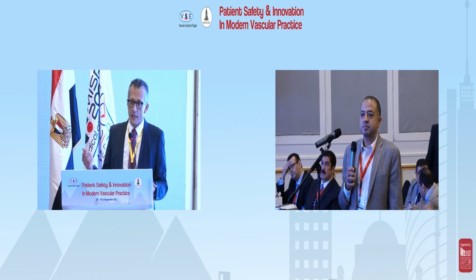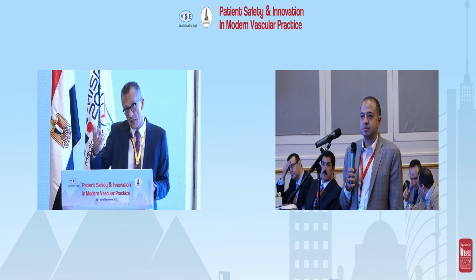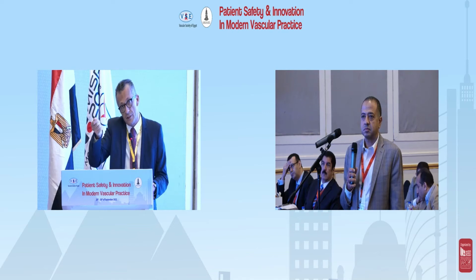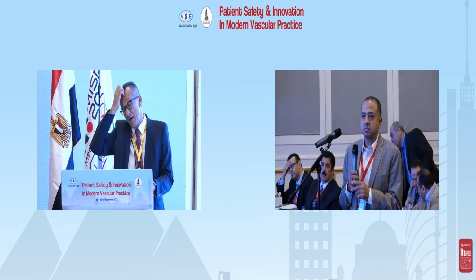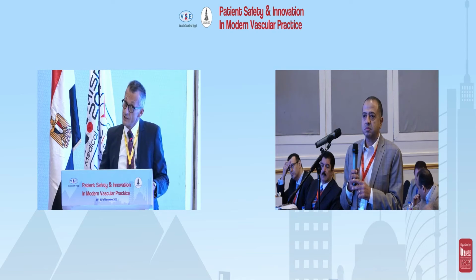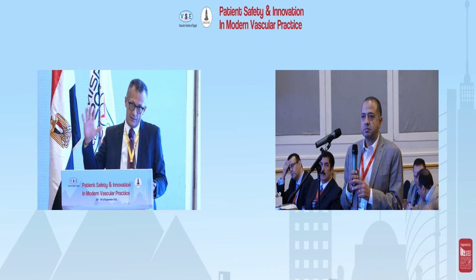In case we are not sure to stay intraluminal along the whole length of the occlusion, you can use Rotarex, but when you are in the subintimal space, or you think you are, stop the engine, cross this area with the engine stopped, and then retreat the device. But of course, in very long chronic occlusion it's really difficult to be sure, and then probably it is not indicated in this type.